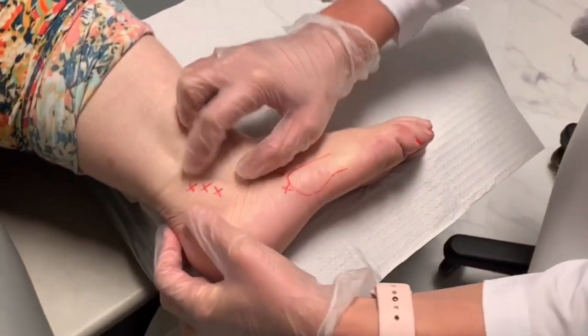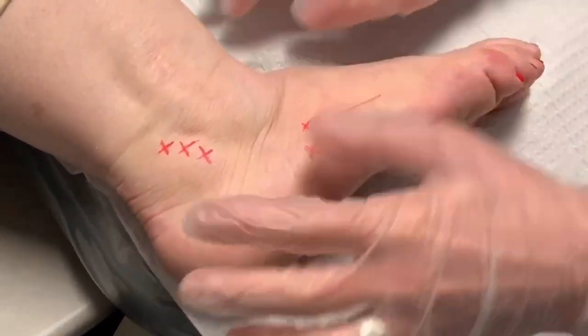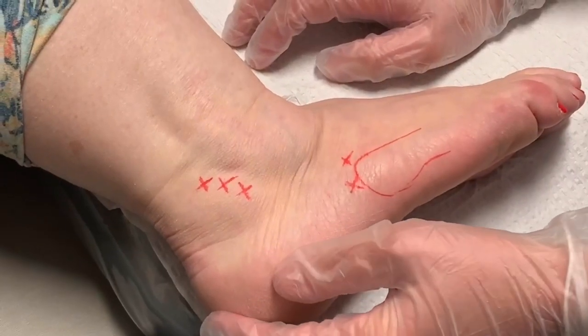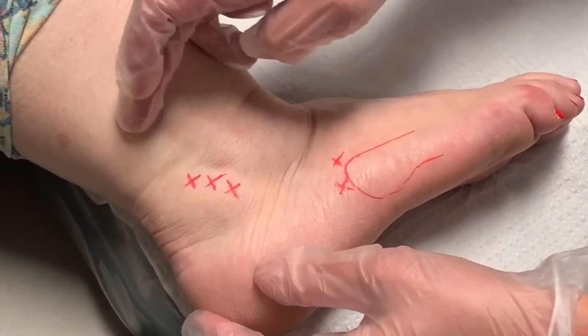It's a very, very small needle — the smallest that we possibly can use — and it would just be like getting a TB test or an allergy test, with maybe a little bit of a burn. I've identified her hot spots, and you can see there is inflammation just sitting around that tendon. This is a common area where people have tendonitis or even tears in the tendon, because it courses down this way and then reroutes direction.